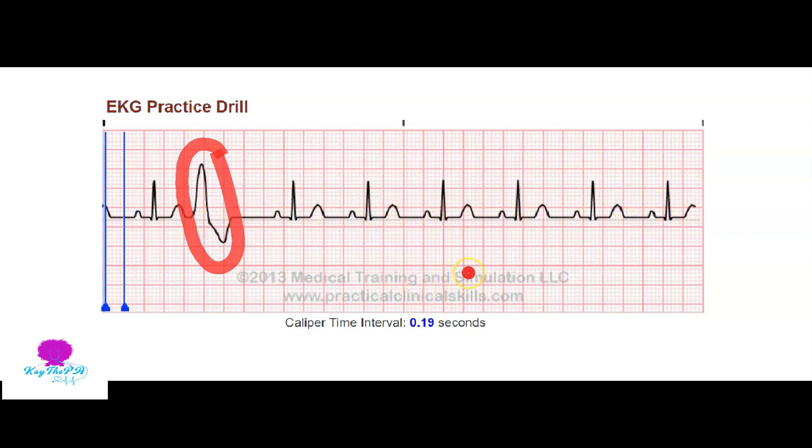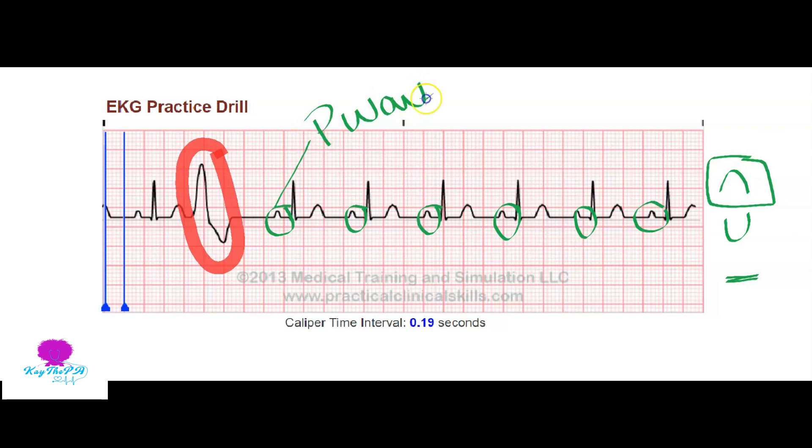Everything else looks pretty good, so the next thing we're going to do is make sure that our five waves are there. If you don't know what those waves are, go back and watch the first video. The first wave is the P wave - we have a P wave here, here, here, here, here, and here. When looking at P waves, you want to make sure they're all upright. If it's inverted or missing, we have a different kind of rhythm. Here it's normal because it's upright.